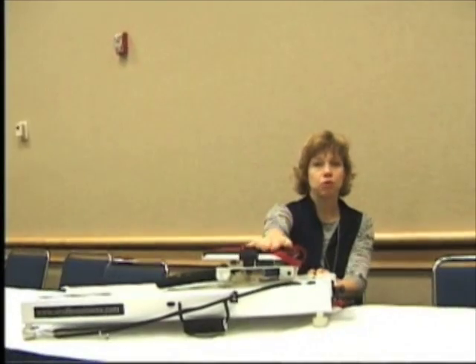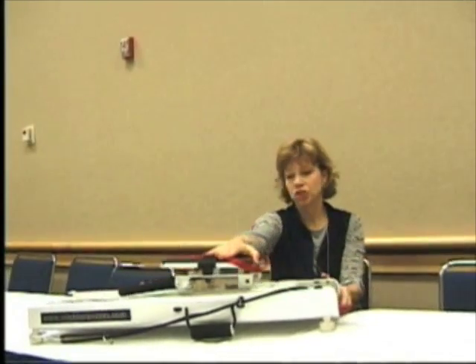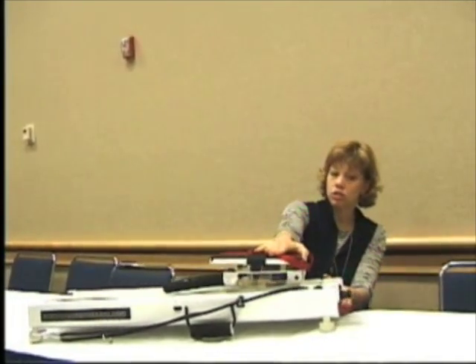Another exercise that we do is we work on the hip abductors. I put the footplate down for that. The subject puts their foot up on the footplate and they abduct their leg, again in a supine position. For this exercise they're going to use a lot less force, and the Mini Clinic is able to accommodate very small forces as well — about 5 pounds up to much larger forces — so it allows me that versatility.